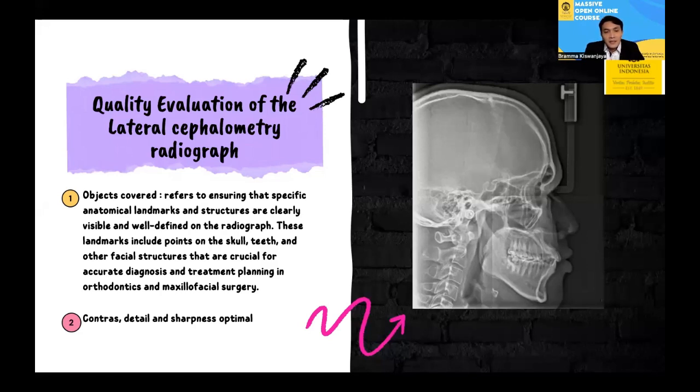Having introduced the key concepts, now let's delve into the quality evaluation of lateral cephalometric radiographs. The first one is object coverage. It refers to ensuring that specific anatomical landmarks and structures are clearly visible and well defined on the radiographs. These landmarks include points on the skull, teeth, and other facial structures that are crucial for accurate diagnosis and treatment planning in orthodontic and maxillofacial surgery.